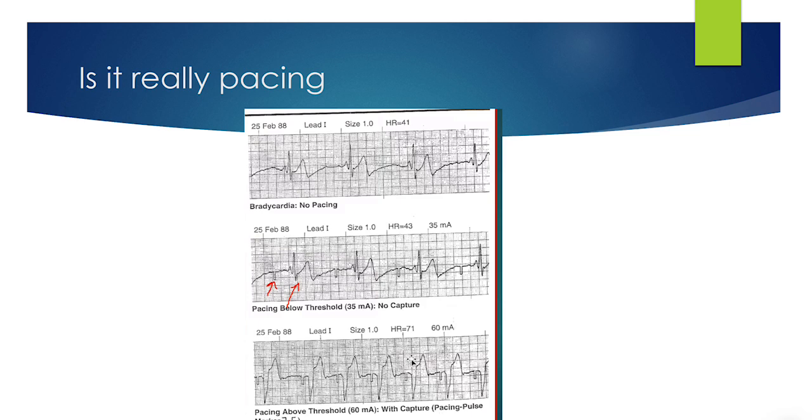If you are doing pacing, I would highly recommend that you momentarily pause pacing and check the underlying rhythm, especially if the patient is not awake, because they might be in cardiac arrest now, and it's very tricky to figure out if the pulse you're feeling is just from the pacing and the patient is being appropriately paced, or they're actually in cardiac arrest and we need to start CPR. So if we have an altered patient that is not awake, pause pacing, check the underlying rhythm, and then continue pacing again.